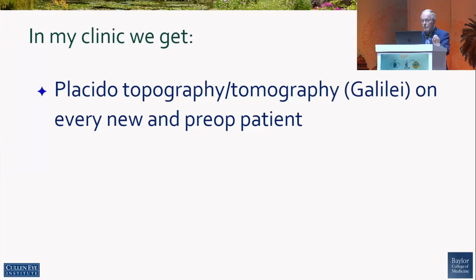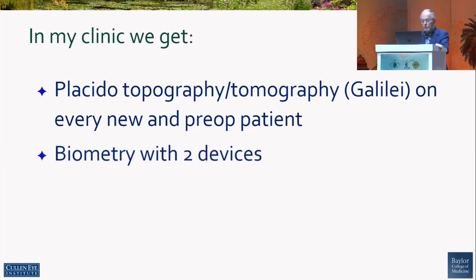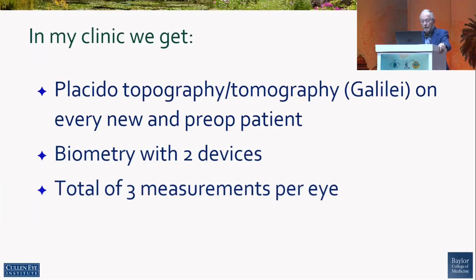And unfortunately, with the Pentacam, you don't get those data. You don't see the image, and you don't get a good sense of the surface quality with the Pentacam. Biometry, I use 2 devices. So I have a total of at least 3 measurements in my patients.